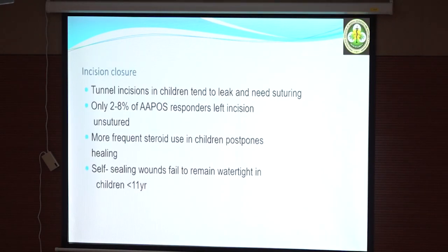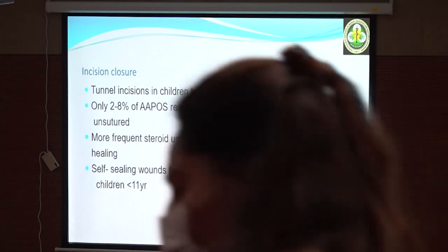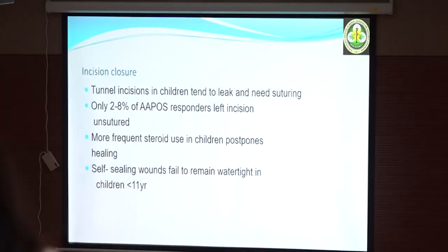Always close the incision. Do not leave them open, because the sclera is elastic, so they are leaky. You use frequent steroids, again which postpones healing. So it's always better to suture these incisions and not leave them sutureless.